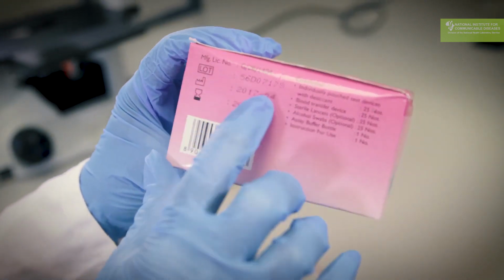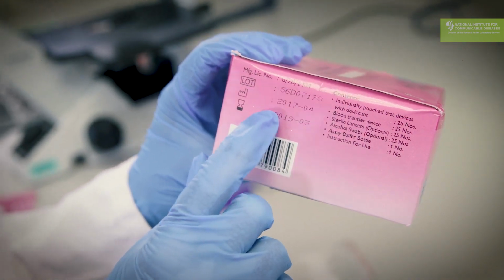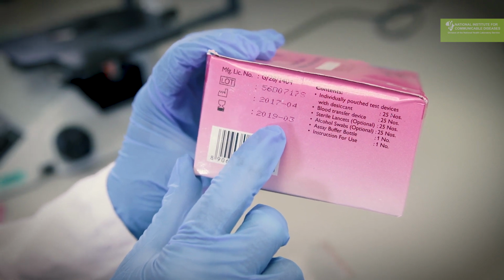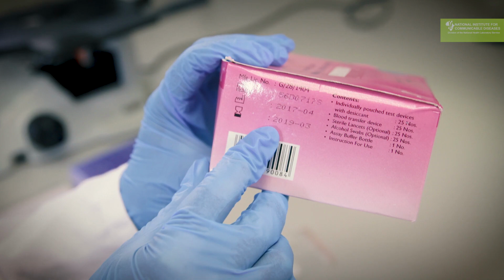And here you have got the date that it was manufactured. So it was manufactured in April in 2017. And then the most important thing is the expiry date. And this only expires in March 2019. So these tests are still valid and therefore you can use them.